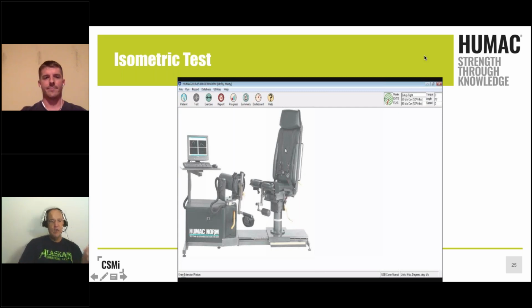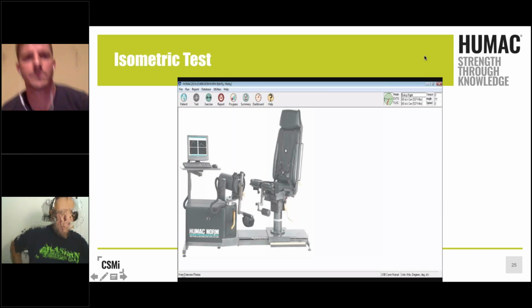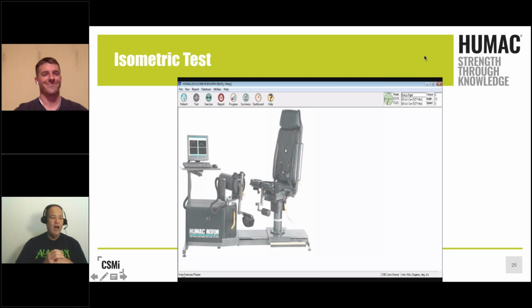And that's what becomes important, because a lot of times we already know, if we just look at a quadricep, for instance, that eccentrically we should be stronger throughout the entire range of motion than we are concentrically, and we should be stronger by 10 to 30%. So we can measure that both concentrically and eccentrically on the quadricep and hamstring. But let's look at those soccer players in particular, the ones that really have a lot of hamstring injuries or strains occurring now. Is there a better way for us to measure their force production, especially of the hamstrings?